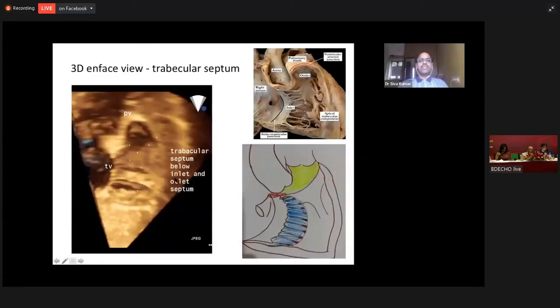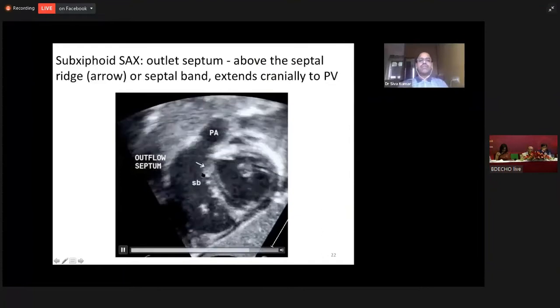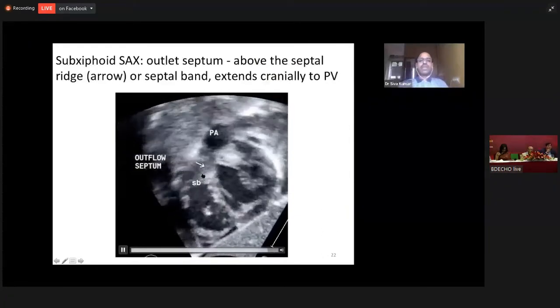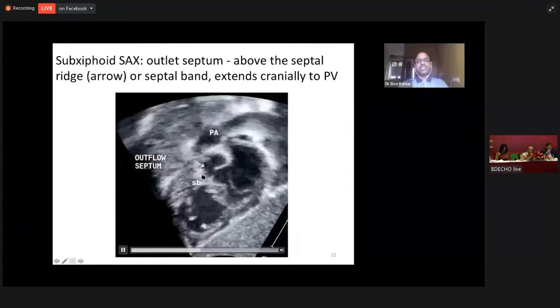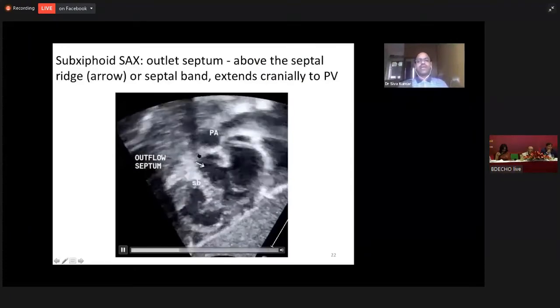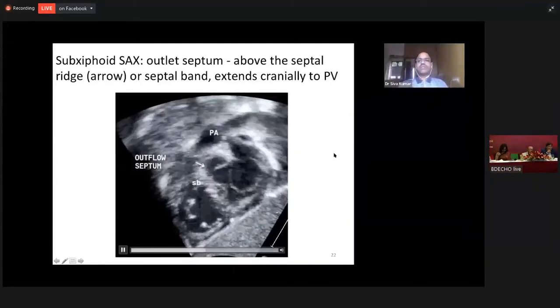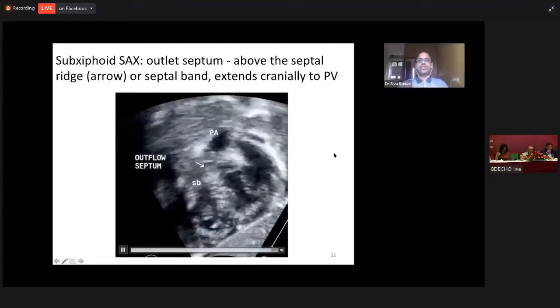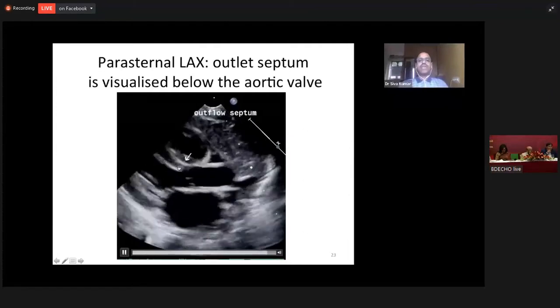Now we go on to the outlet septum. The outlet septum is above the trabeculo septum marginalis. On a subcostal short axis view, above the septal band and below the pulmonary valve is the outlet septum. On a parasternal long axis view, the portion that is immediately beneath the aortic valve is the outlet septum.